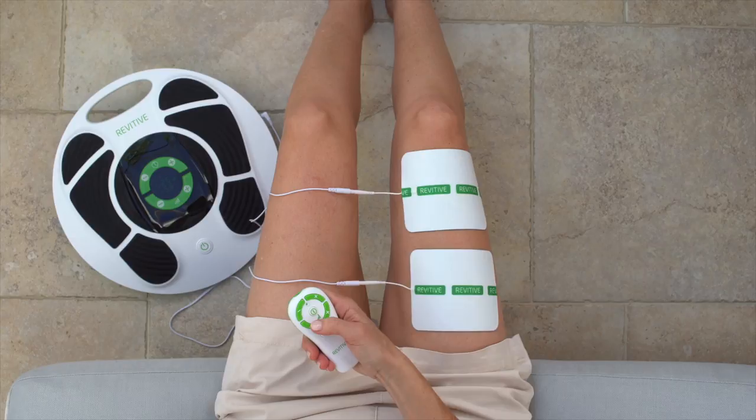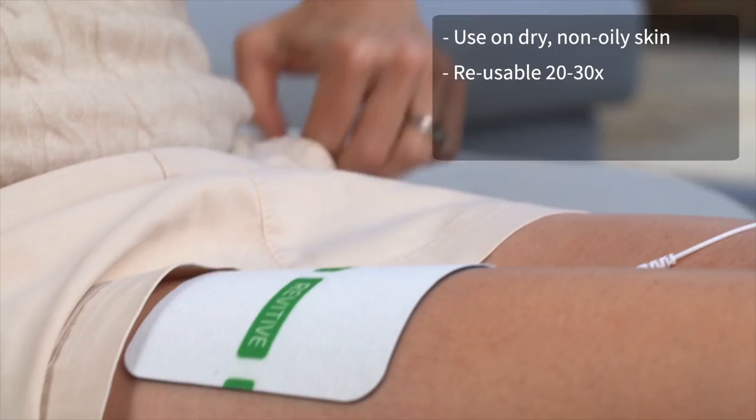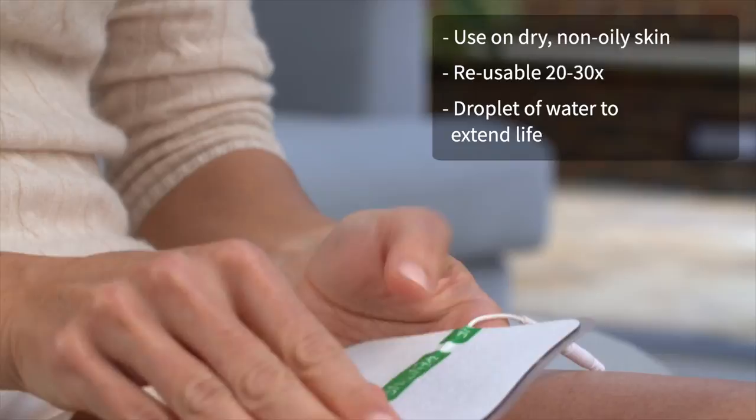When used on dry, non-oily skin, the thigh pads are reusable up to 20 to 30 times before needing to be replaced. If the thigh pads start to lose their stick, just rub a few droplets of water onto the surface to extend their life.